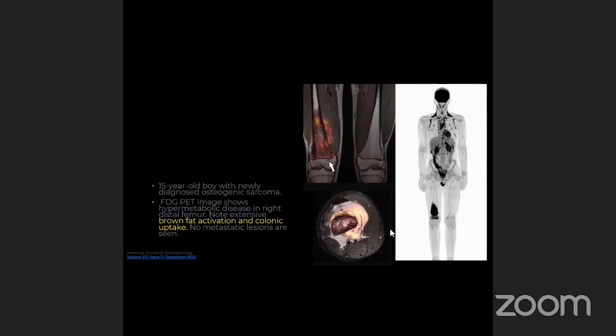Okay. So from your experience, you find a lesion active in the distal femur, what is your provisional diagnosis? Yes, the answer is here. It is osteosarcoma. Yes, usually it is osteosarcoma. And it has some of these criteria, as we know, of an aggressive lesion. The aggressive lesion has a wide zone of transition. You remember when we talked about this, this is what you have to mention for the viva. So wide zone of transition, and there is a soft tissue component.